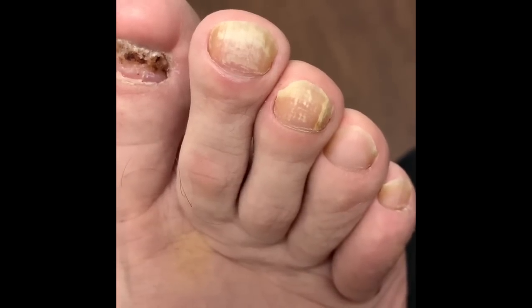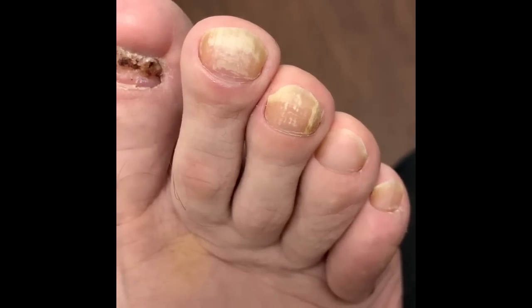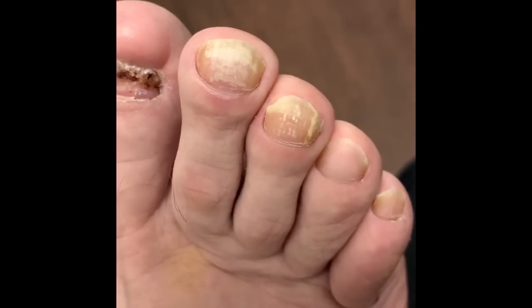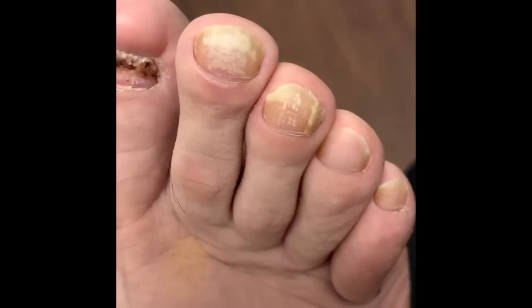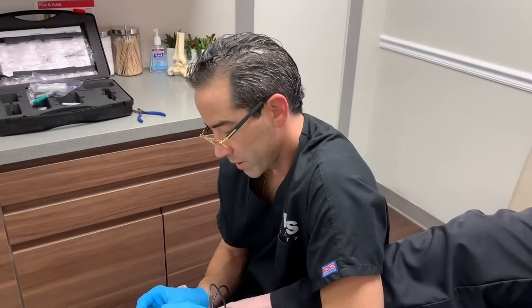What we're going to do today is the combo — the Pathformer, the robotic micro drill, as well as the laser treatment which we will perform next week. The first thing we're going to do is make the tiny little holes on the nail plate, and then next week we'll go ahead and do the laser. Welcome back everyone, we already started the procedure.